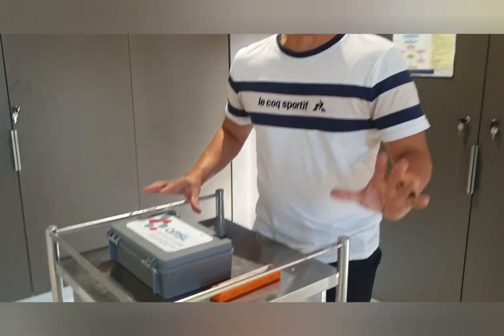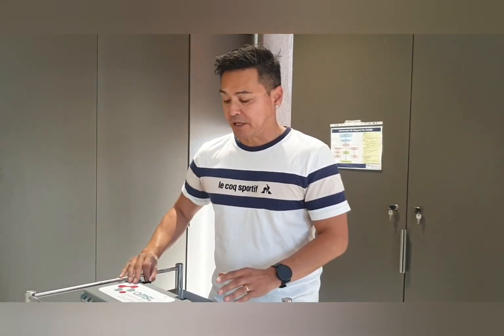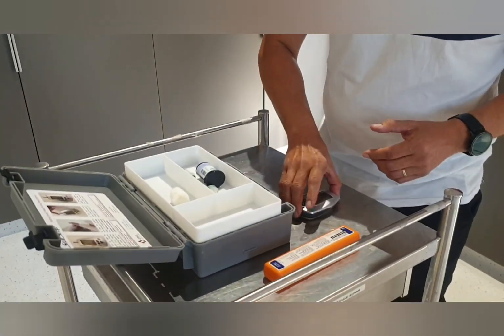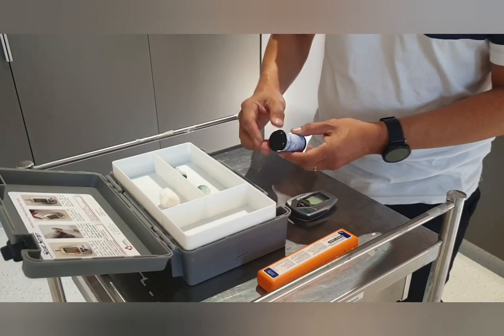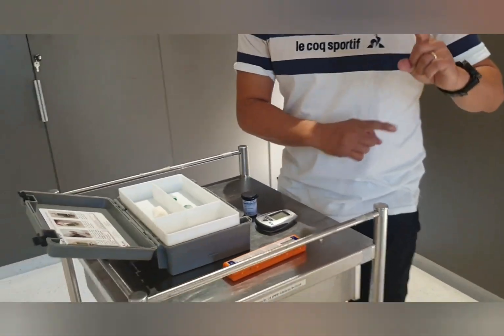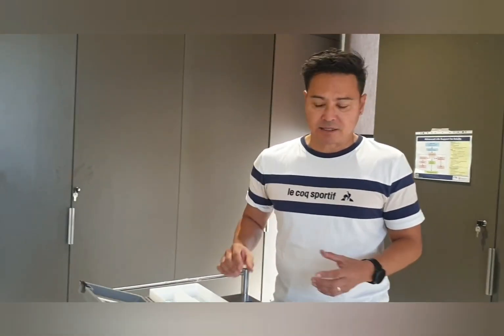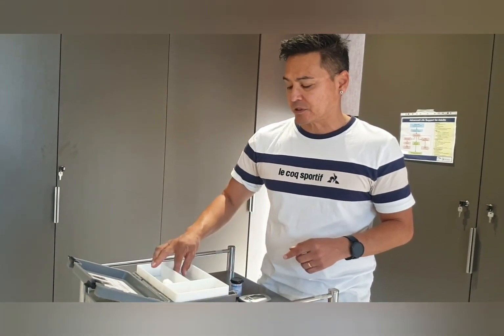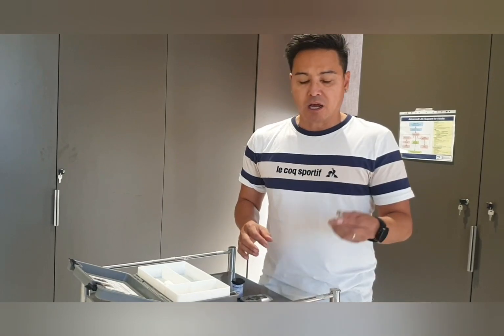We've put a picture of the equipment you'll need, and this is the glucometer we're using. I've got my testing strips — there are two types: one that checks for glucose and the other that checks for ketones. The procedure is exactly the same, so you really need to look at the jar of test strips you're going to be using.